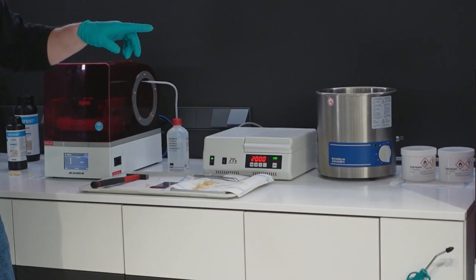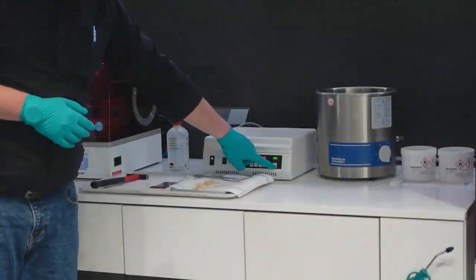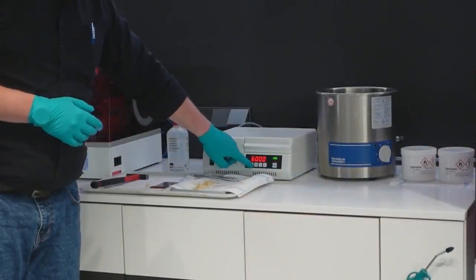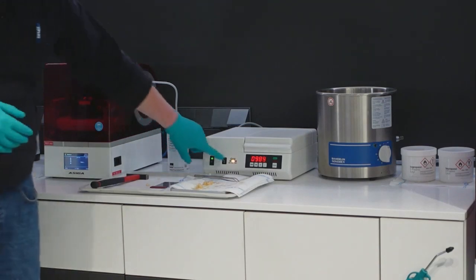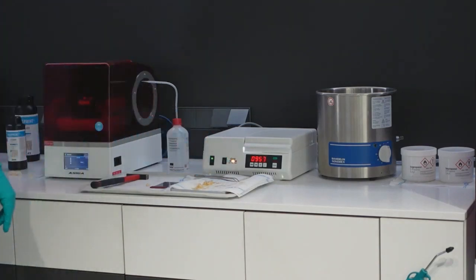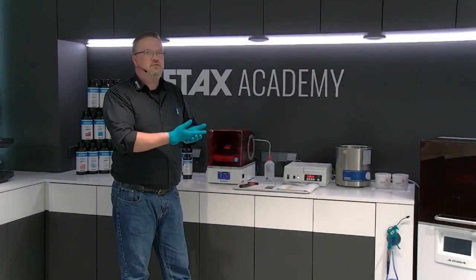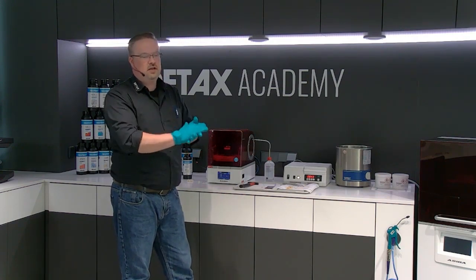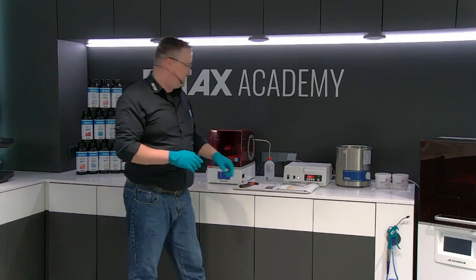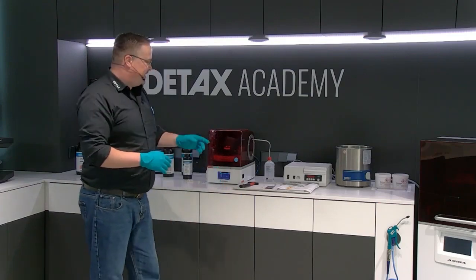Make sure that the gas is open, and you can start 2000 flashes now. I will do it here only for the show. Make sure the gas is okay, so there's a yellow lamp. You need 2000 flashes from one side, turn it around, and after that 2000 flashes on the other side, to make sure that in all areas there's enough light to cure the object finally. I will take this off because it takes too much time and the noise is not good.